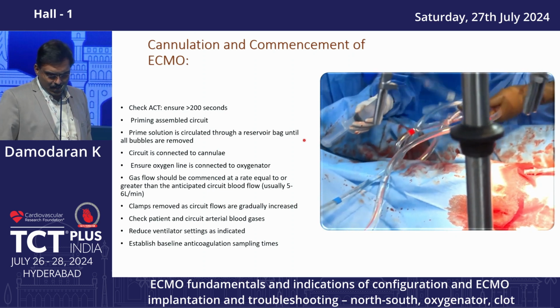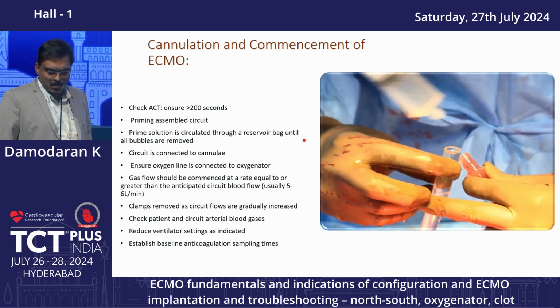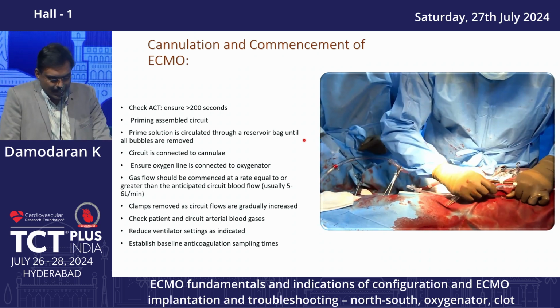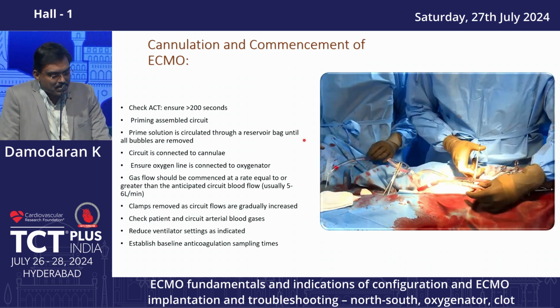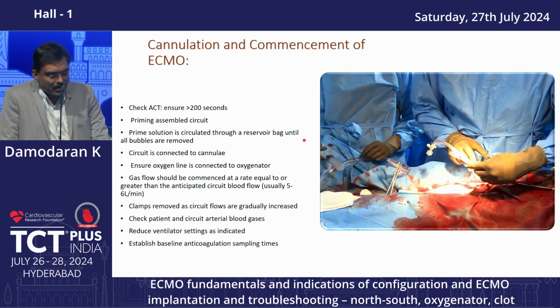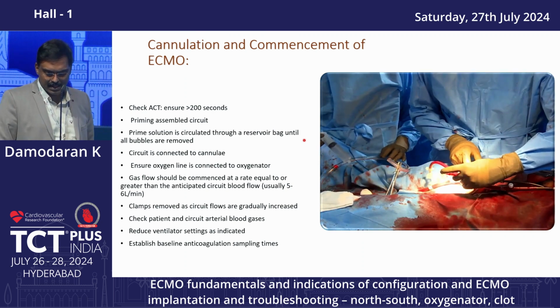The one thing we need to know is that when you are connecting the cannula, there may be some air. So you must be very, very careful in relieving the air when you are connecting this cannula. Otherwise, the oxygenator will fail. And the gas flow should be equal to the circuit blood flow, whatever you are going to give. So we have connected it.